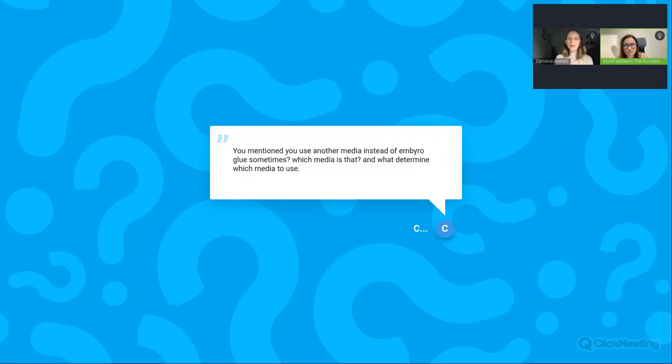I think each laboratory is going to have their own media standardized, in terms of all the culture being optimized for that culture media.